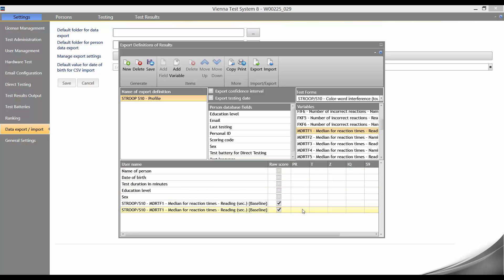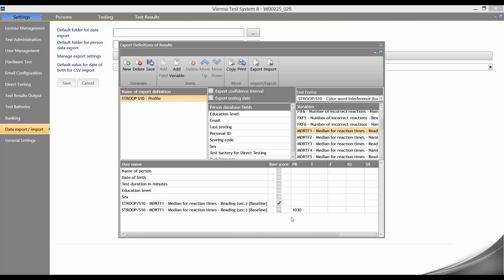We then click once on the white box in the PR column. A drop down menu appears and here we can select the required norm sample. Here we select representative norm sample 1030.